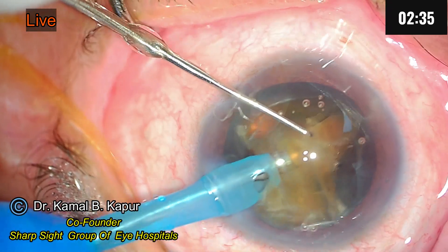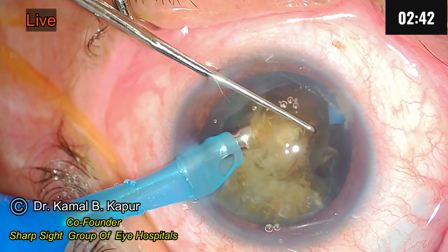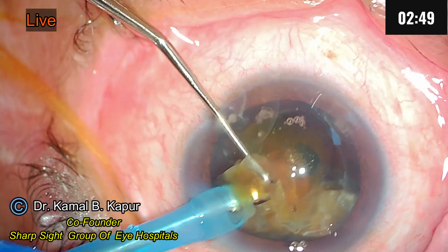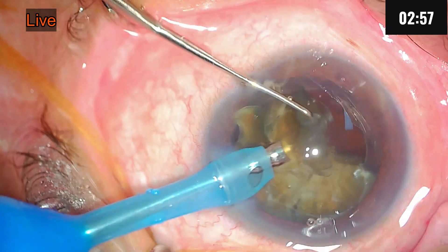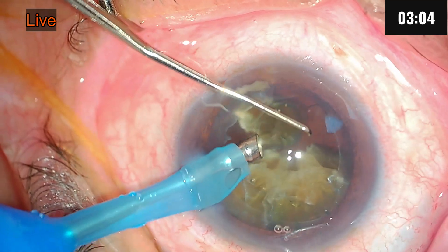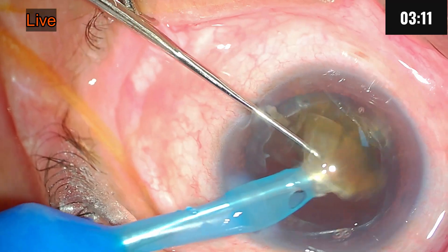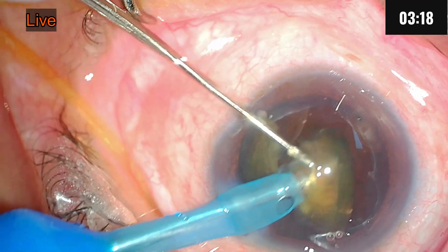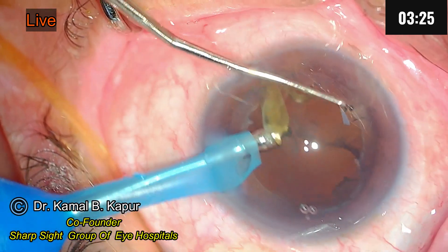So it's a good idea to use a long flank chopper. When I am operating a black-brown cataract, in spite of the fact that I am using FEM2, I would like to break the occlusion off and on and ensure the cooling of the phaco tip. As you can see, the posterior part of the nucleus is absolutely black. I am giving breaks in between — it is a straight Grade 4 cataract. Add some fluid once the occlusion is broken to ensure cooling of the inner lumen of the FEM2 as well. This will ensure that the probability of a wound burn is reduced to near zero. In spite of the fact that I am using cool phaco mode on my Stellaria machine, I am giving gaps in between and letting some fluid run through the phaco tip to ensure a good cool tip.